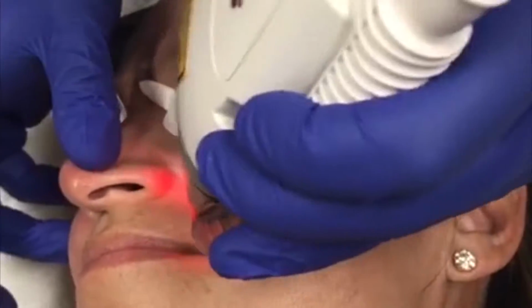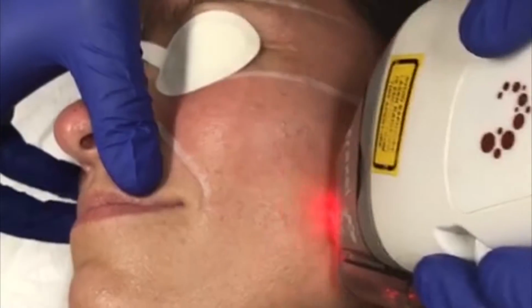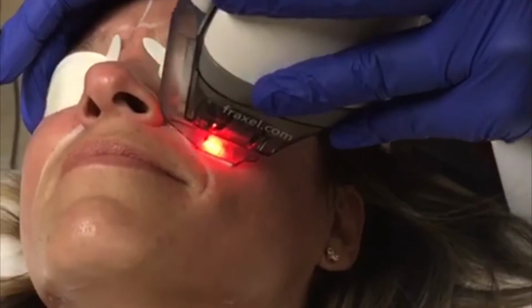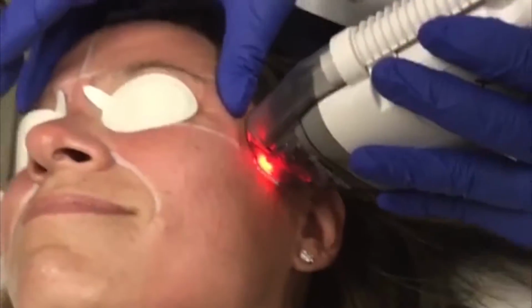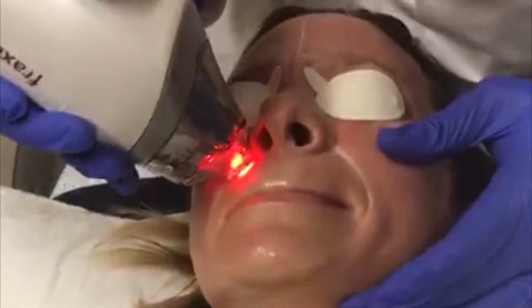Technically, it's very important to mark a patient's different anatomic areas to make sure that all of them are being treated, but even more importantly, to make sure that they're not being treated twice and we're not treating the same area over and over, because if you're over-treating, you can certainly cause a local burn. So this particular patient was marked with an eyeliner pencil, and you can see different zones being marked.